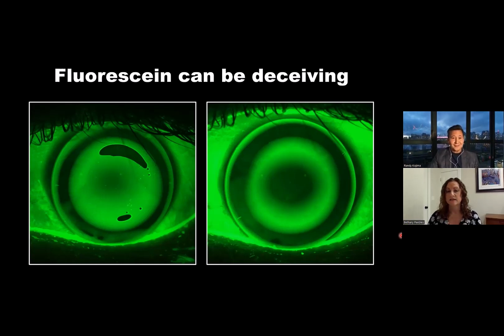Yeah, so it's really uncommon for a lens, honestly, to not be dispensable. And if a lens truly is not dispensable, then we are looking at the data that was used to design the lens to make sure that there wasn't maybe a typo or something that's throwing it off, just because it is so uncommon that if we see a lens that's truly not dispensable, then something is amiss. Because in most cases, that first lens that you're going to receive is going to be dispensable.